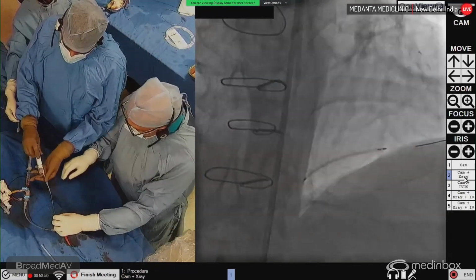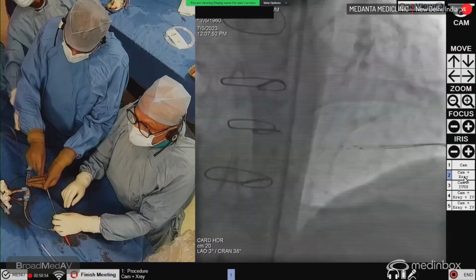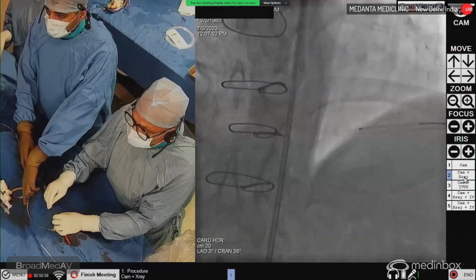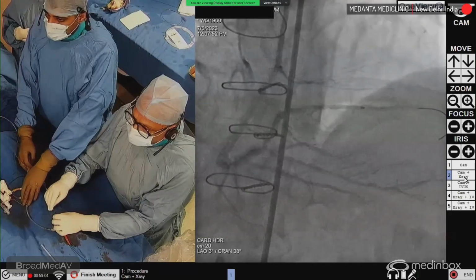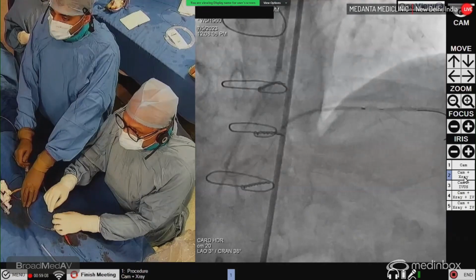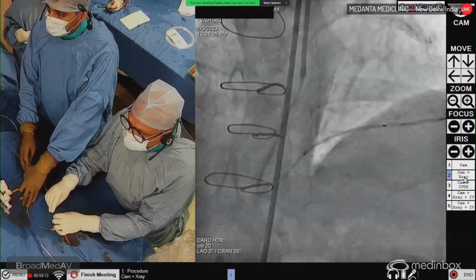Check, please. Connect quickly. Where is the stent gone? Every time you push the stent distally. Check, please. No, I am fine now. Okay. Take a quick shot. Yeah, this looks fine to me.